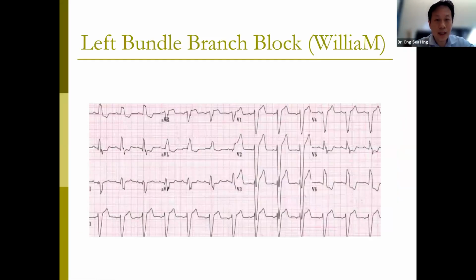A little bit about left bundle and right bundle, because this is another important thing that we need to know. We can memorize ECGs and use pattern recognition. Once you see enough ECGs, you will know straight away what it is when you look at the ECG. Some of us are not as used to looking at ECGs so often, and so there are some principles.